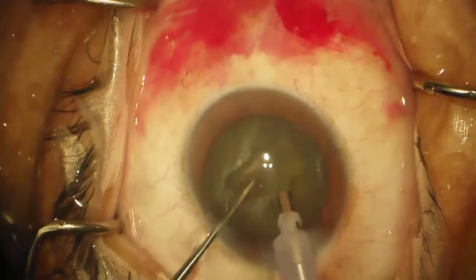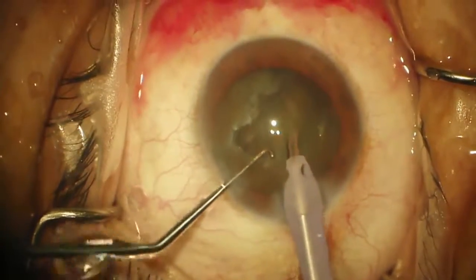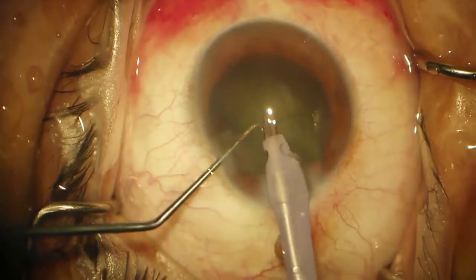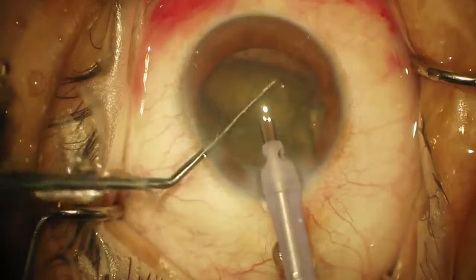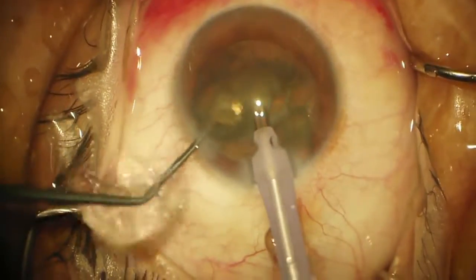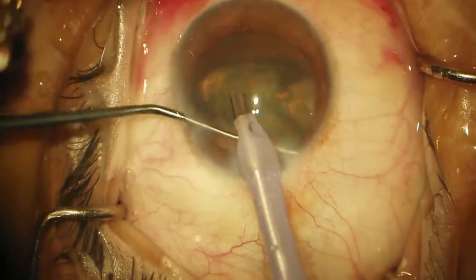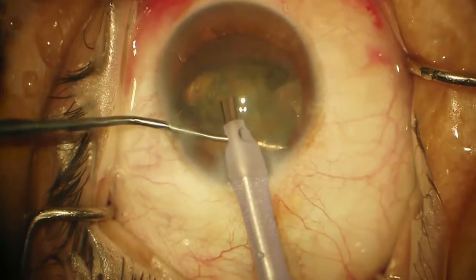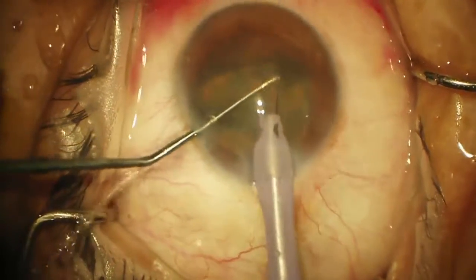Now I'm going to switch parameters — my vacuum is higher. We'll just go ahead and remove that little segment. You can see it's so loose the other ones want to come, and I'm going to leave the phaco tip right where it is. That quadrant is up on top so I'm just going to sweep it down.